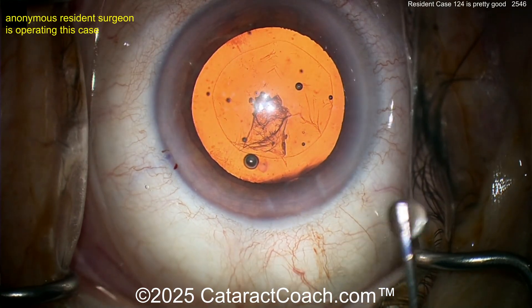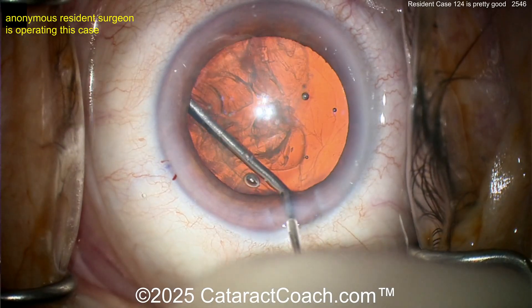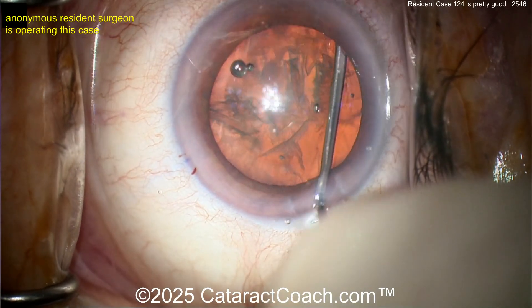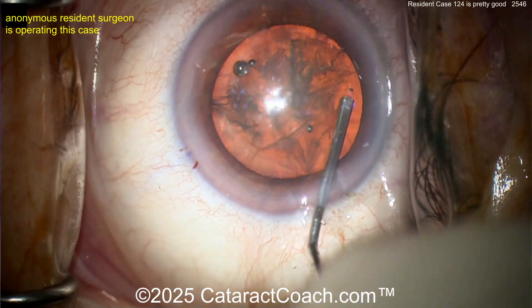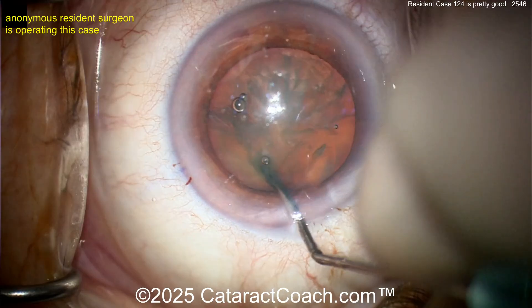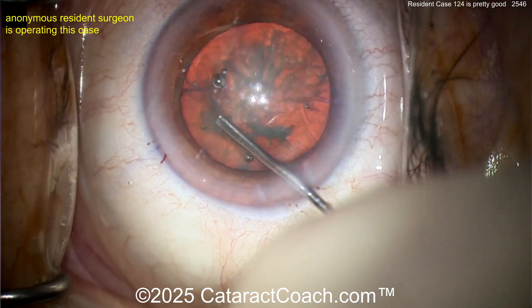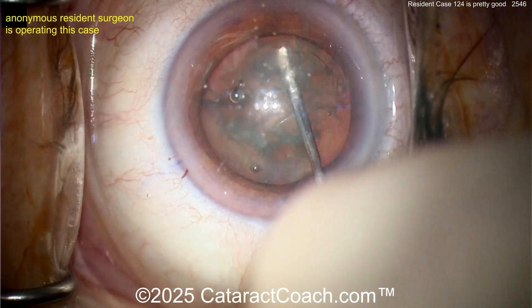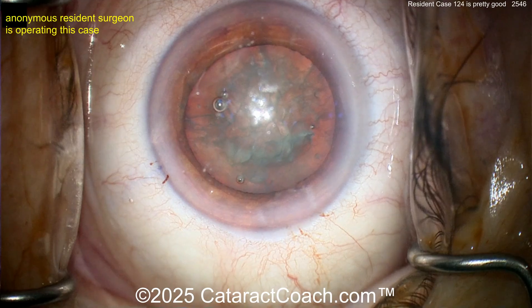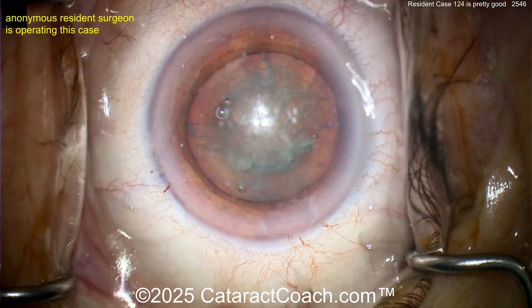Now releasing some viscoelastic. Let's watch the hydrodissection. Here's a flat-end cannula going in — a little bit of hydrodissection, there's a good fluid wave. Tap the center, then hydrodissect on the other side too, then tap the center again. That looks good. Now let's see if it spins — remember, if it does not spin, you will not win. Try again, a little more hydrodissection. I'm not 100% convinced it's spinning.